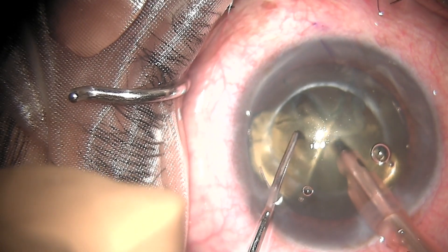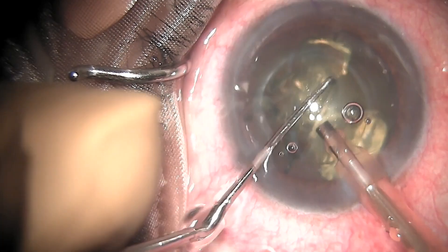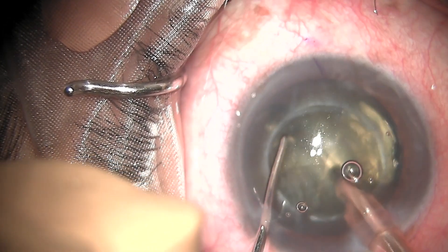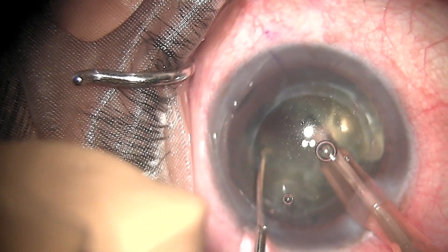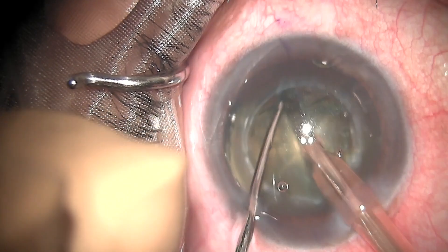I have started doing a stop and chop technique where the central trench is made. The nucleus is rotated and the other side of the trench is being completed. Once the trench is complete and of adequate depth, I am cracking the nucleus into two hemipieces. You can see the trapped air is being released.